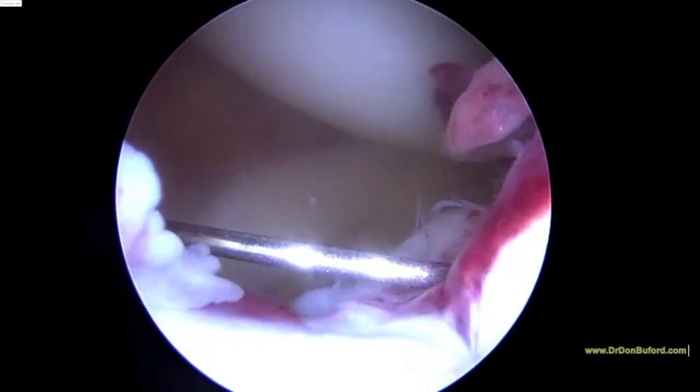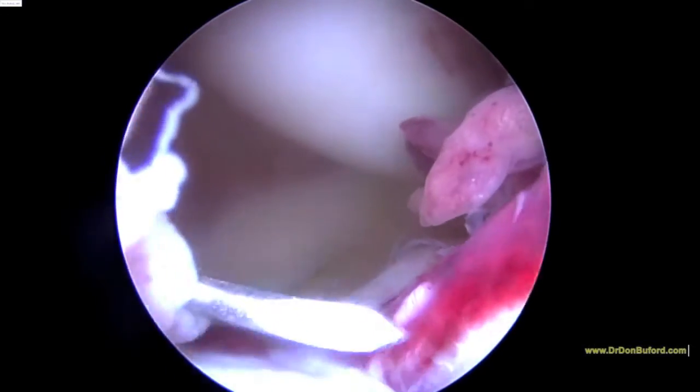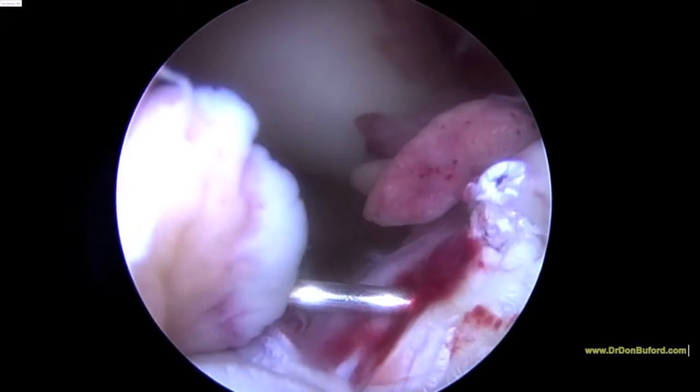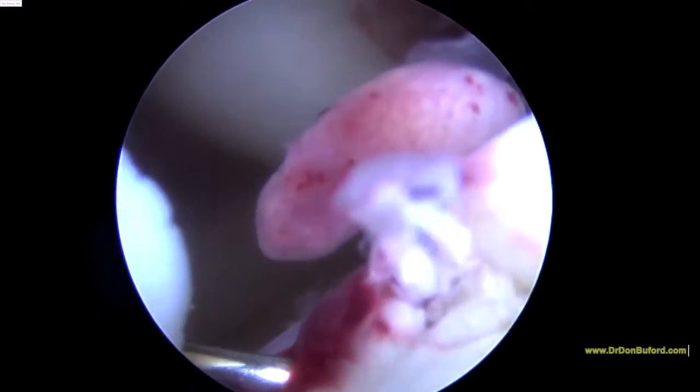What we're going to show you now is a 22 gauge needle. We're going to inject some methylene blue into the base of the tibial stump — the tibial ACL stump. And what you'll see here is that that methylene blue extravasates almost immediately with no more than half a cc, actually less than that. And clearly there's no intact sheath.